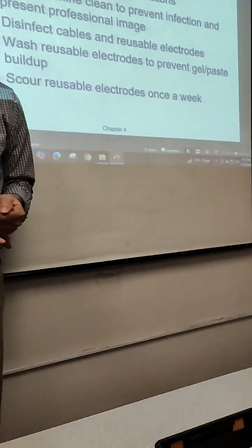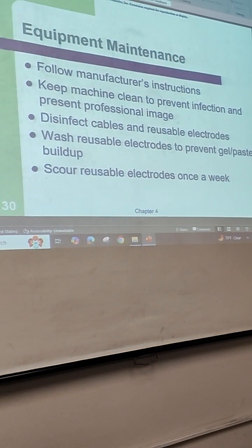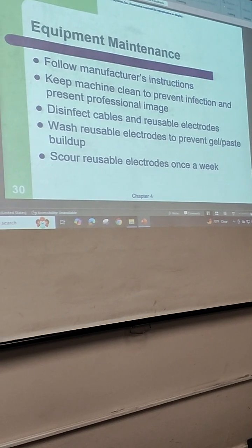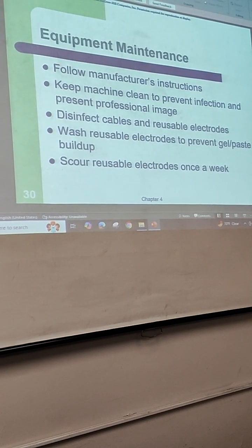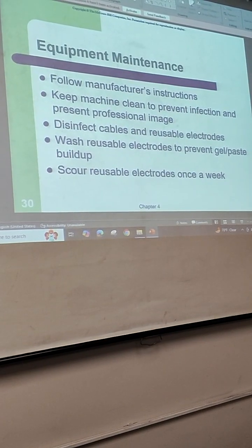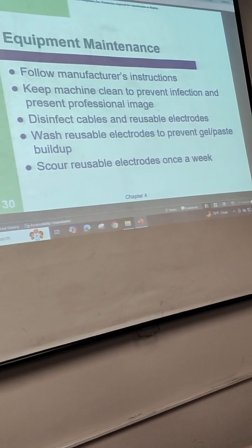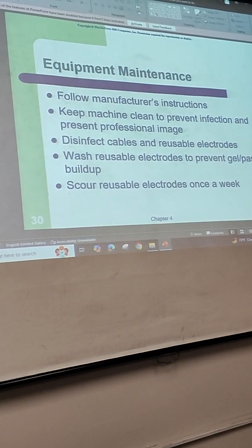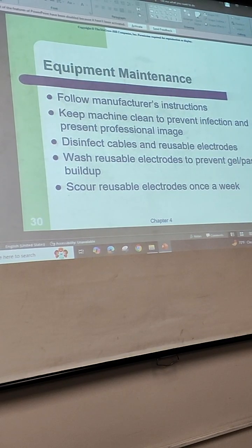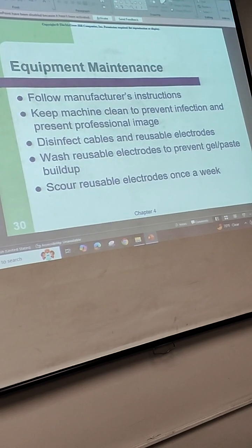Equipment maintenance. Now, it's not that you're gonna fix the machine if it breaks. You're not gonna open it up and put new pieces. No, that's not what they do. It's to maintain it clean, so that the wires are well kept. Every single time that you use this equipment, it's like when you use your charger from your cellular. Make sure that you treat it nicely, otherwise it's gonna break. The part that connects where you plug it, that's the part that damages the most.